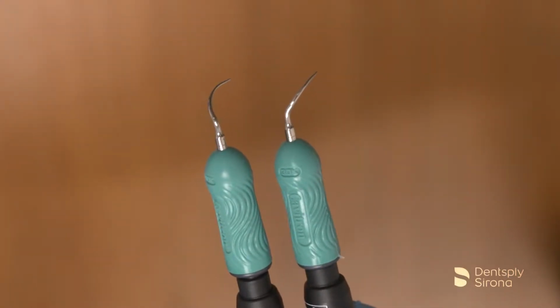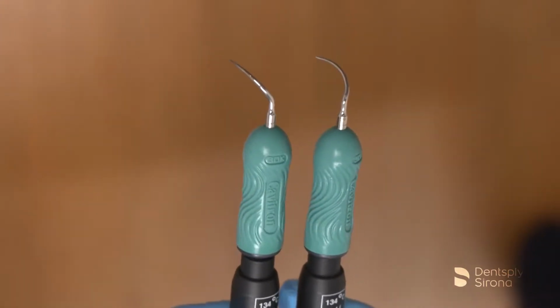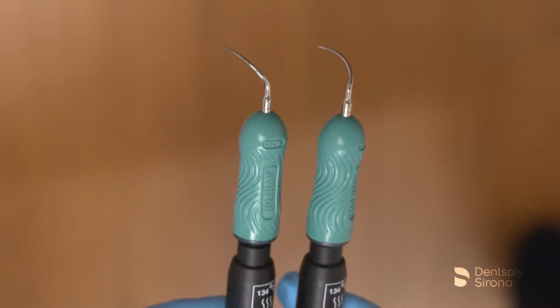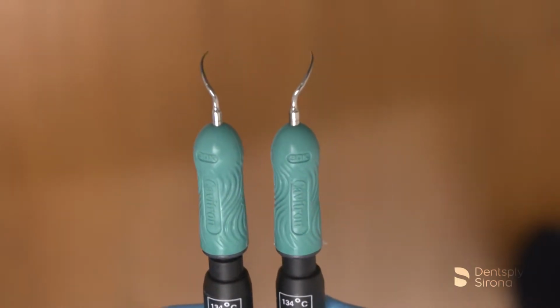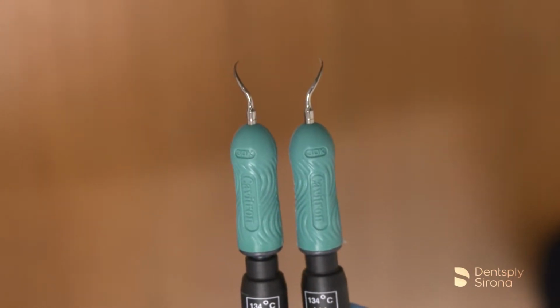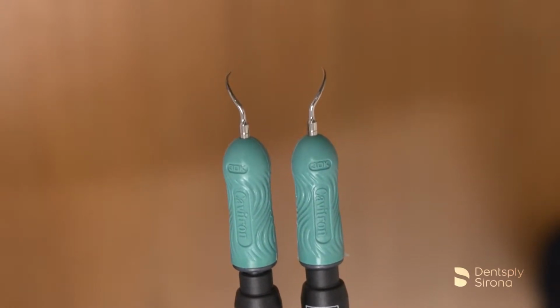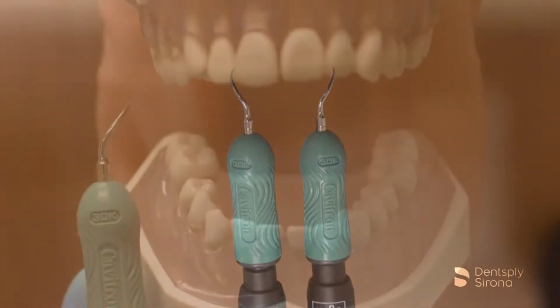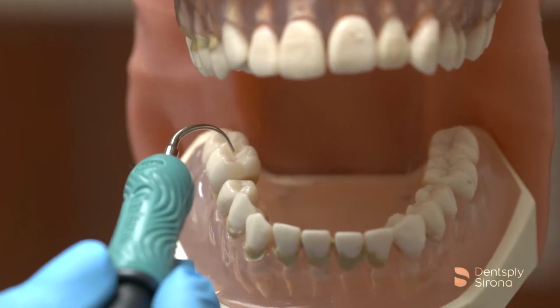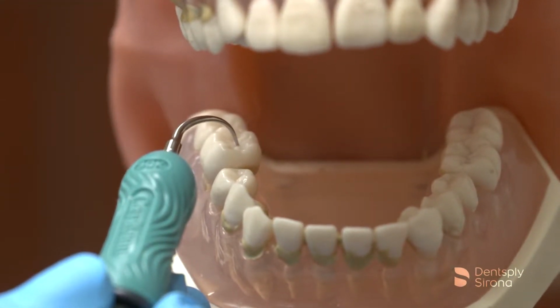Adapting the curved insert properly requires a fundamental knowledge of the tooth's anatomy and proper placement on the appropriate tooth surface. In order to identify which insert one is holding, it is recommended to begin by holding the inserts parallel to the floor with the points facing down, or perpendicular to the floor with the points facing away from the clinician. The right insert will curve to the right and the left will curve to the left. It is also helpful to place the insert on the occlusal of the intended tooth, as demonstrated here, to see the curvature to ensure you selected the correct insert.